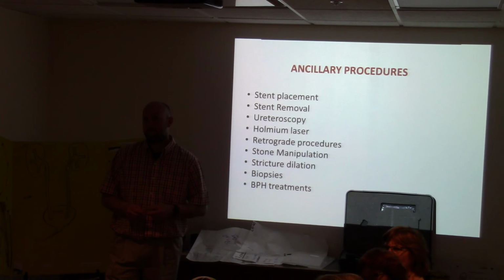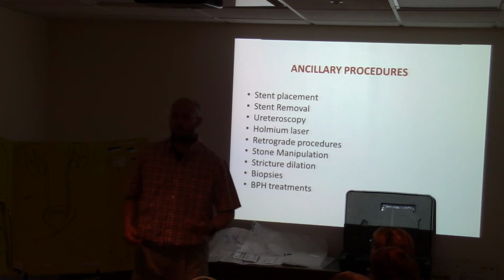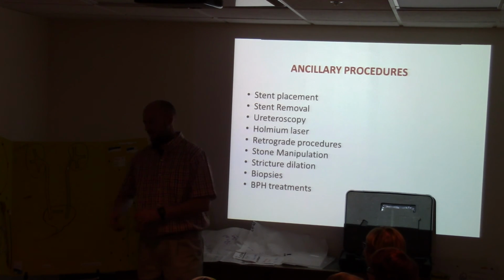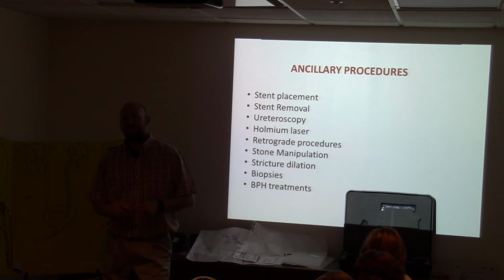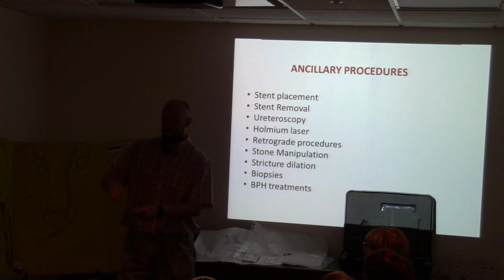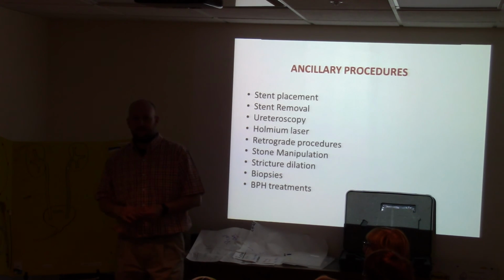This is just logistically. How many pieces of instruments is the physician holding at the same time to maneuver through the procedure? Usually they're all set up on a back table, so they're pretty much just holding the scope, and then working through. The assistant, the scrub tech, will hold the wire and hand them the other things. So it's not like they're balancing a circus. But a lot of stuff hooks to that scope. It does. The water hooks to it. If they need the scrub tech to get something else, they'll take hemostats and pinch the wire to the drape, and then the scrub tech can get something else. So they have ways to work around only having two hands.